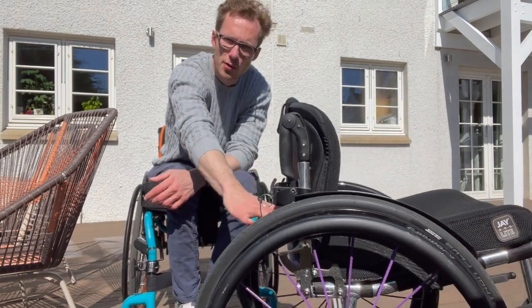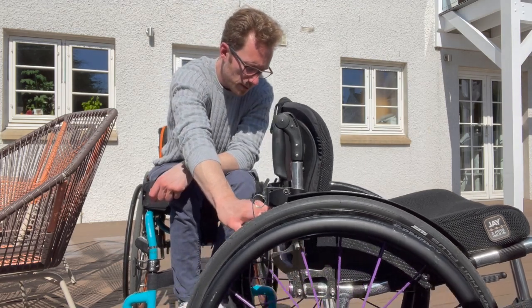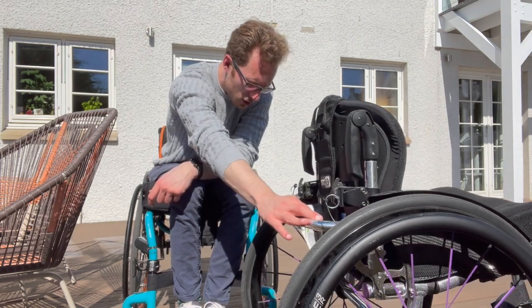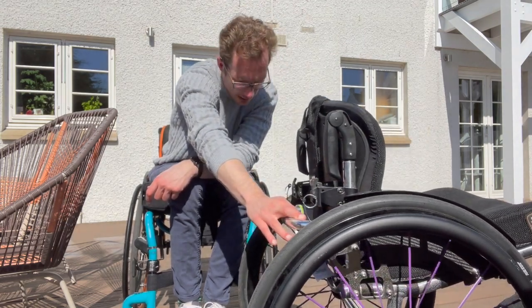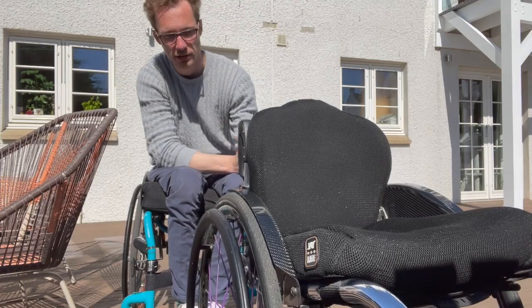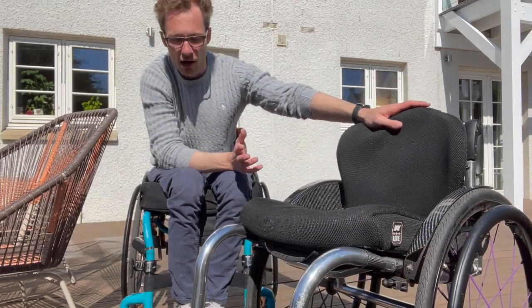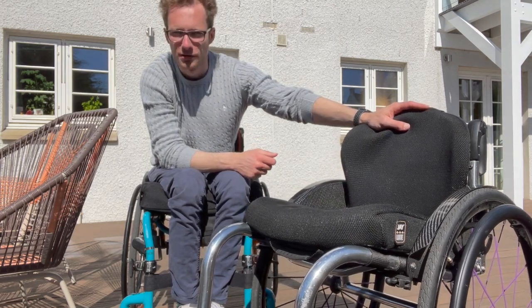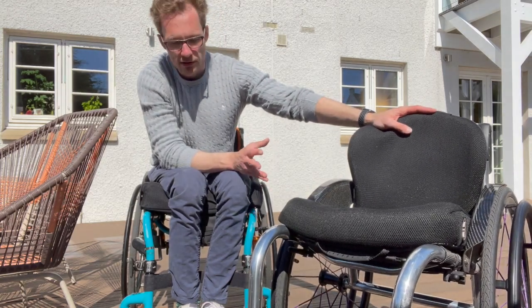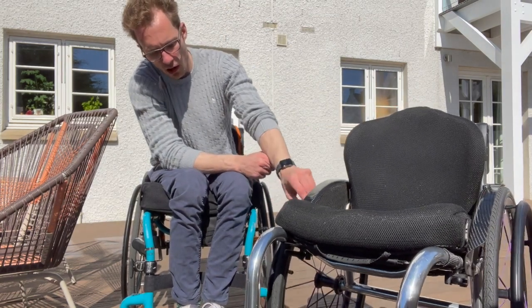The wheels are Spinergy — I think they're BL XL wheels with 18 spokes and they are fairly lightweight. The tires are Schwalbe Marathon Plus, which wasn't exactly what I had requested but I think they come standard on so many chairs because they're really good. I've never had a puncture with one, though I've only been a chair user for a year and a half. They weigh about half a kilogram each, which is quite significant when you think of the overall weight of the chair.